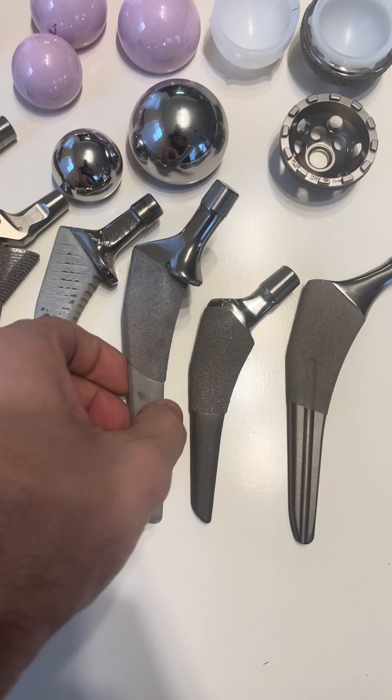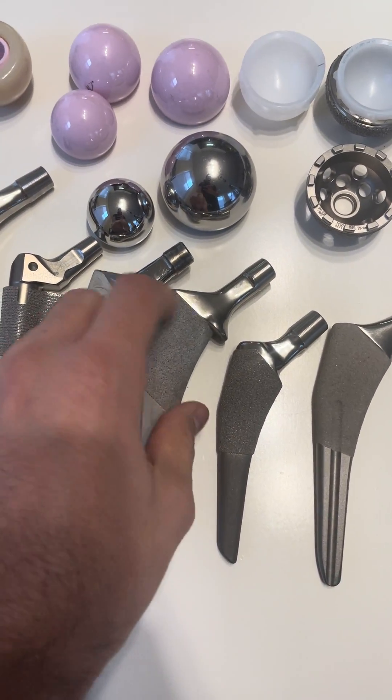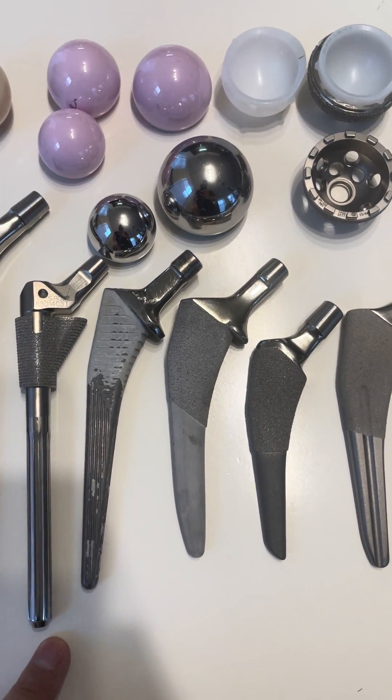This is another type of trapezoidal stem. You can see by the design it has a collar on it, so you can use it in a little bit worse bone. It's also smaller, meaning it can be put in through a minimally invasive approach.